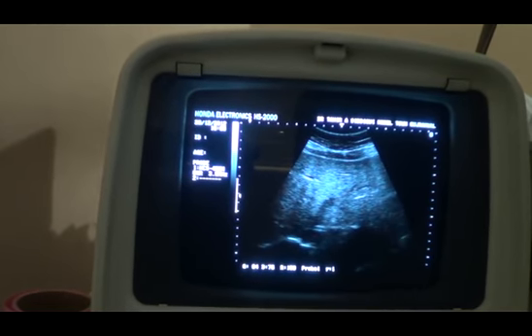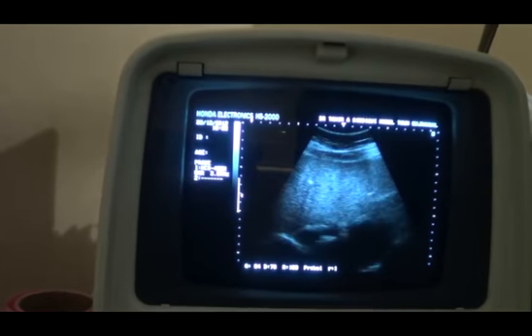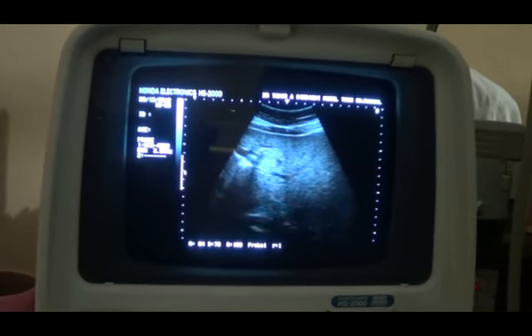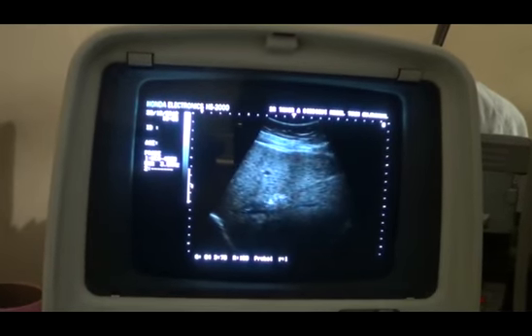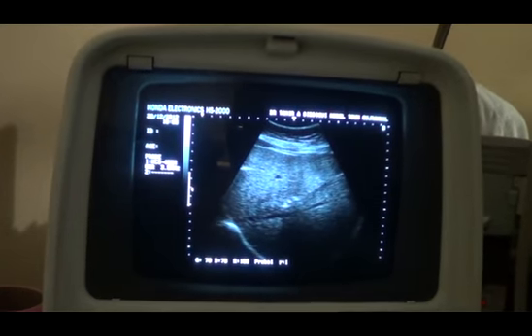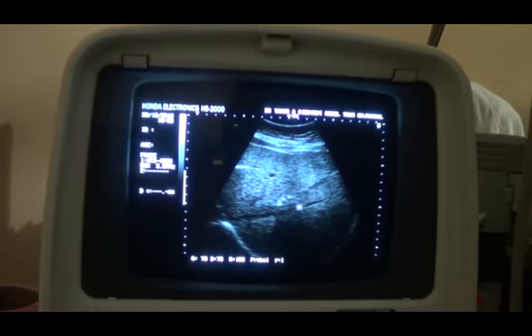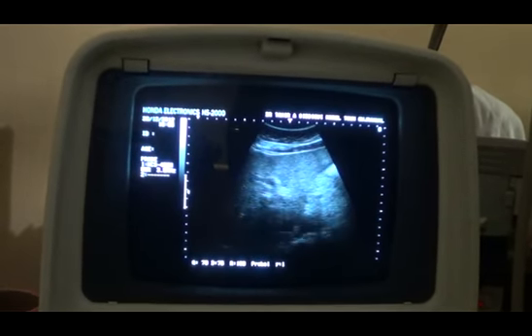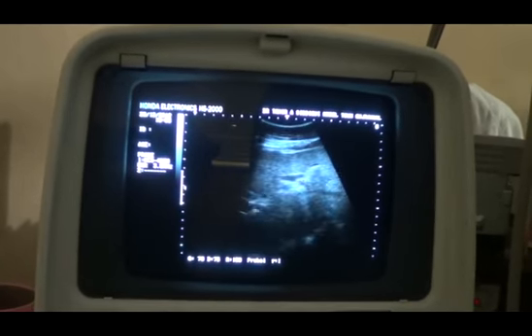Now the hepatic veins in level 1 fatty liver will appear sharp. Their margins will be sharp, as you are seeing here. You can note the sharpness of the vessel margins in this fatty liver. This is the hepatic vein, and you can see that the margin is sharp. So this is a level 1 fatty liver by all these parameters.